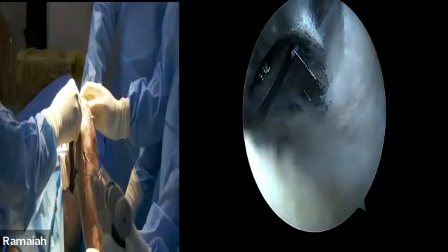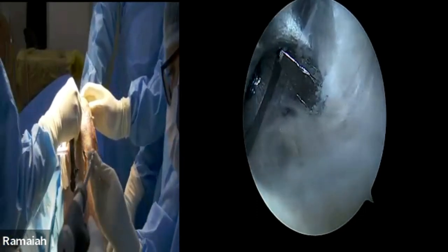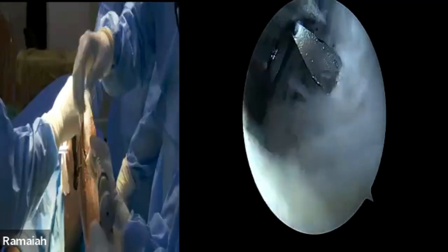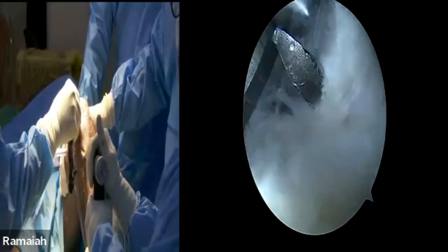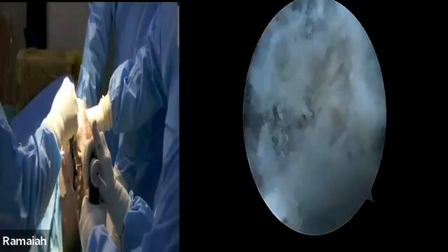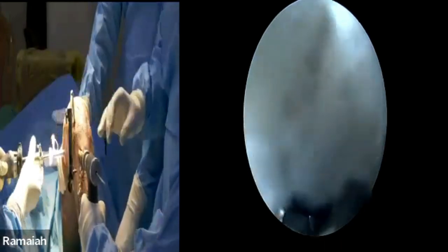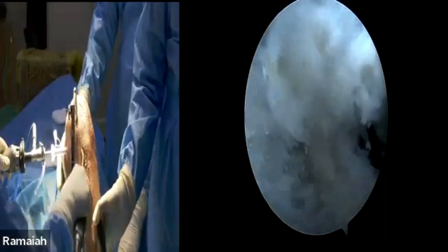Any other way of doing it? Dr. Anand, Dr. Niranjan, Dr. Heyman, Dr. Kautam Kodikal — you can all share your experience so it benefits the audience. Dr. Heyman: for PCL tibial attachment placement, do you prefer going more towards the midline or the medial side? Answer: more towards the midline. Discussion confirms: medial to midline, around 15 to 20 millimeters down.